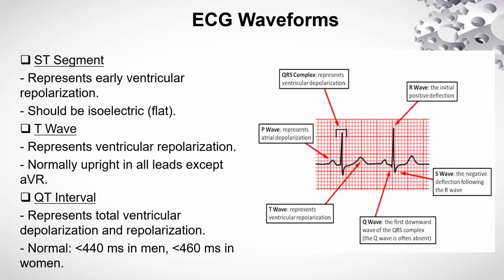So the next thing is the ST segment, and this ST segment is very important because ideally it should be isoelectric, it should be flat.